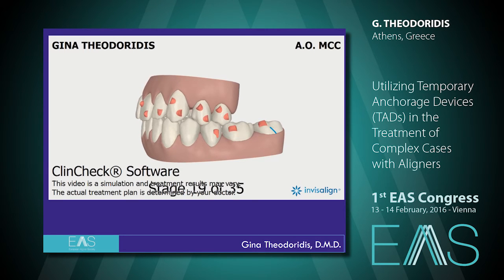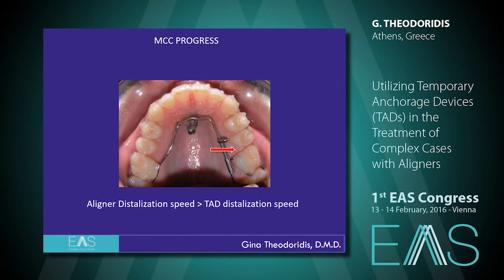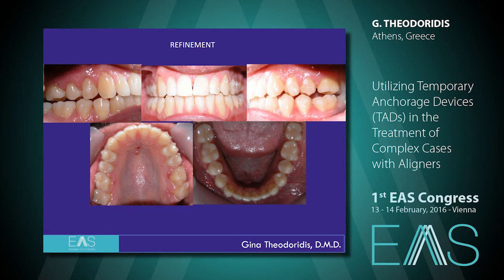You can see here the video of the movements. Because the distalization caused by the TAD system has a different speed than the distalization speed of the aligners, there was some space that developed and it was expected. So we proceeded to another refinement to correct this.